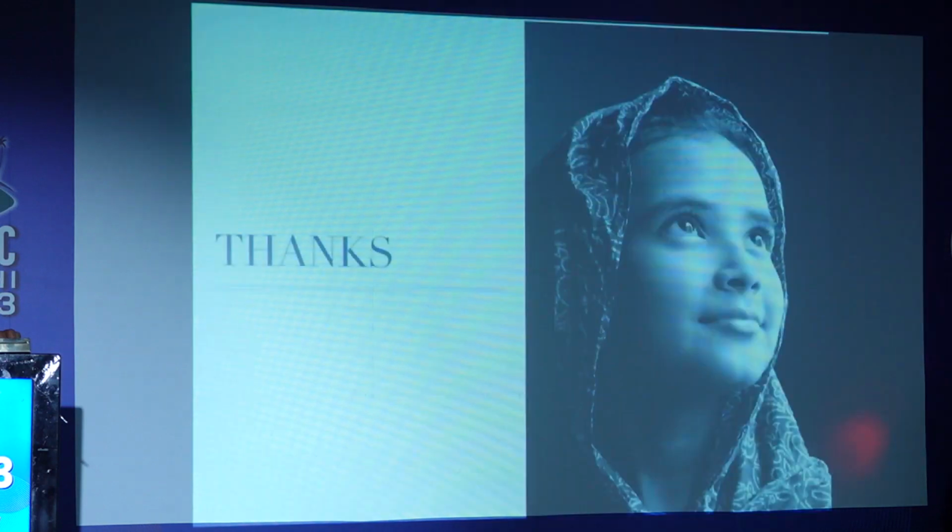And mind me, it works even in... none of the patients have complained of any loss of contrast in these patients, and photic phenomena I find is minimum in these patients. So a great presbyopic correcting IOL that we've been using, and thank you so very much.